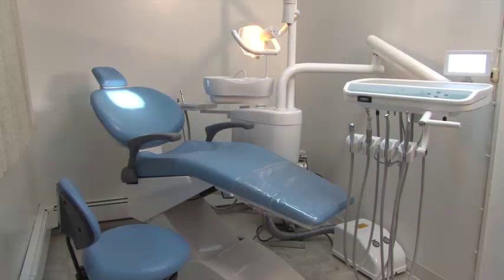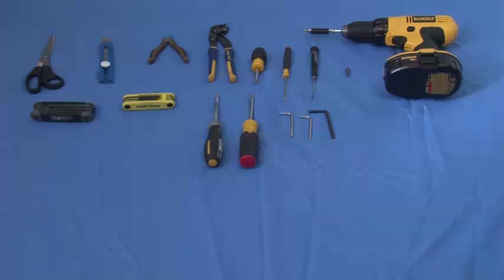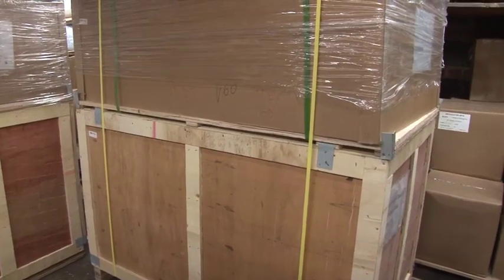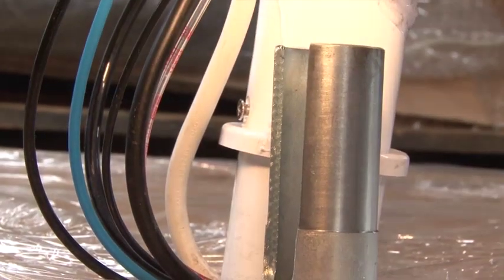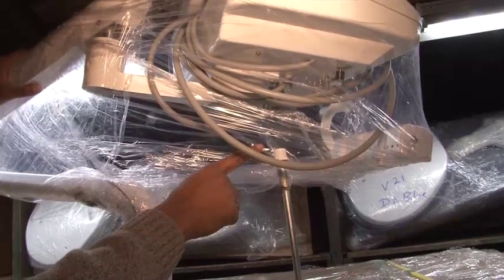Thank you for purchasing the dependable dental chair. Let's get our tools ready and begin the installation. To remove the chair and its components from the packaging, first we need to unpack the top box and remove the safety screws of the delivery tray.